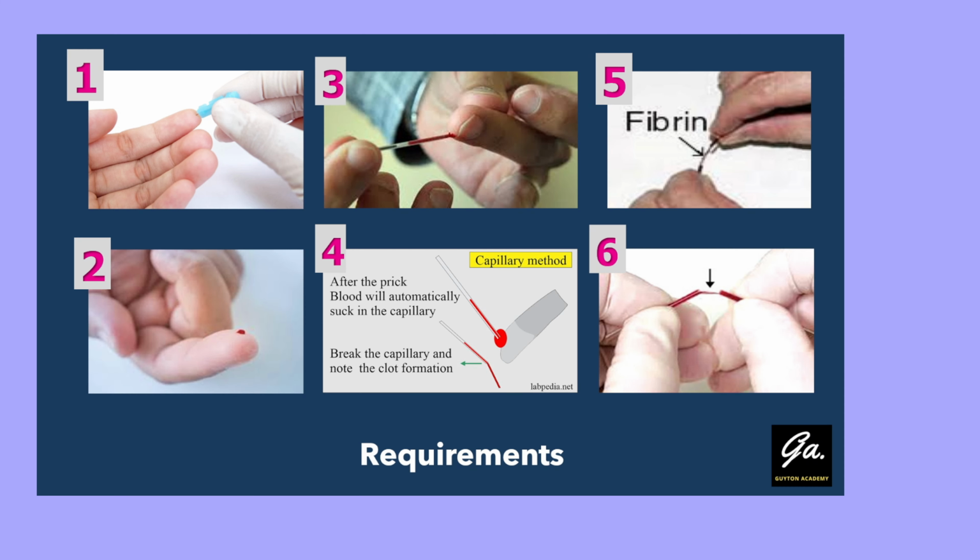Yes, this is the end point. Finally, when we see the thread, it means this is the clotting time, when the clot has been made. So we have to note down this time. It has significance in clinical settings and the human body, so we will discuss it in the coming questions.